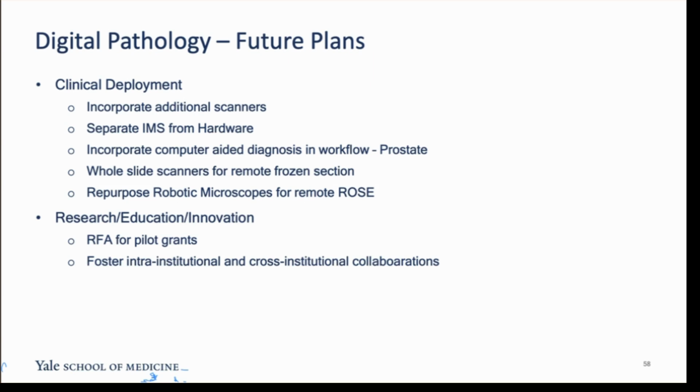For example, in the prostate, Artera AI has an algorithm that is now part of the NCCN guidelines because they proved in a clinical trial that it could provide information that's crucial to management, but that bypasses pathologists. So we have no role in that apart from providing an image to Artera for them to run their algorithm. That's the part that worries me a little bit.